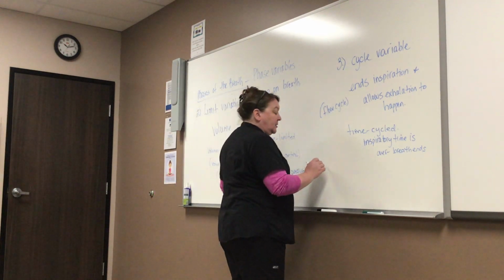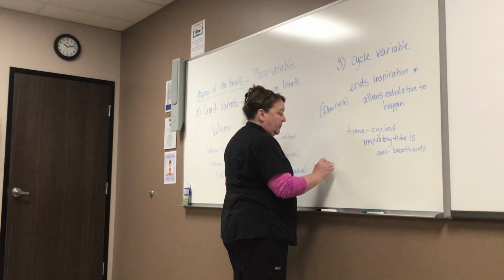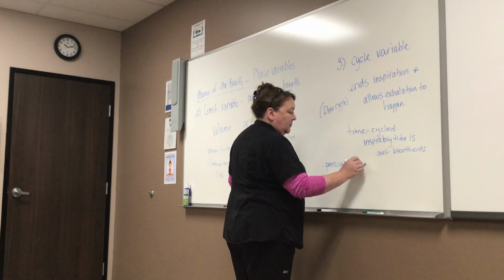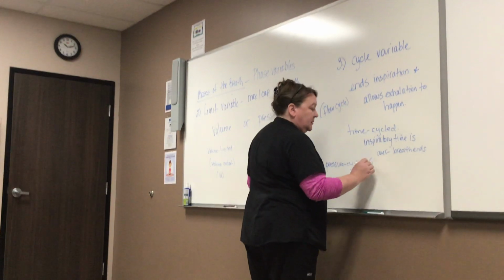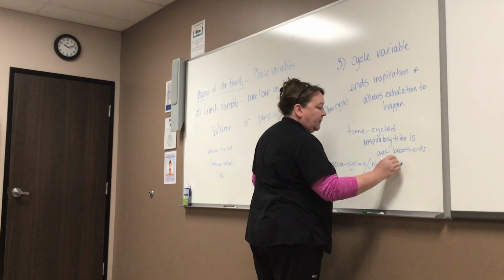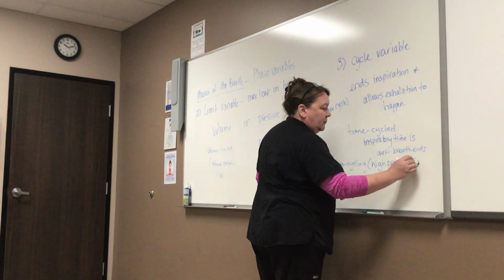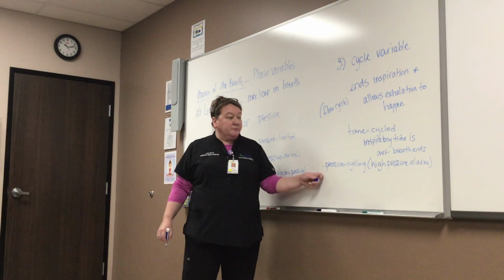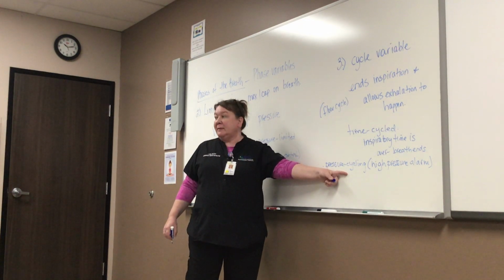One other thing is called pressure cycling. This is the high pressure alarm. Remember that cycle means ends the breath.